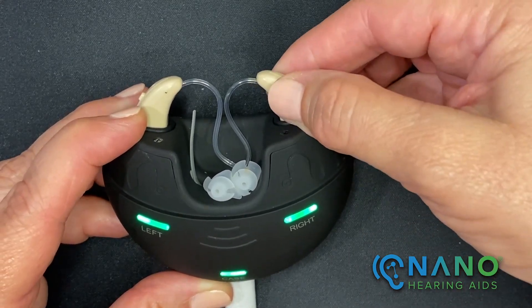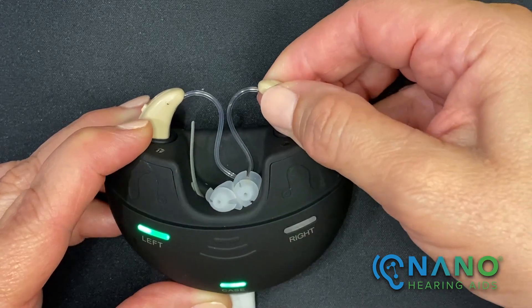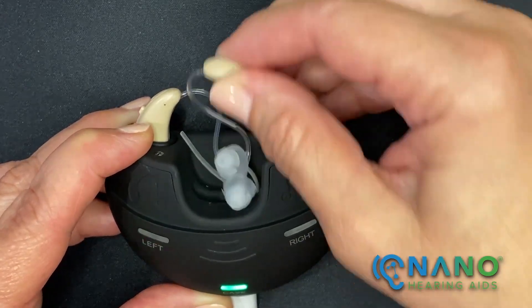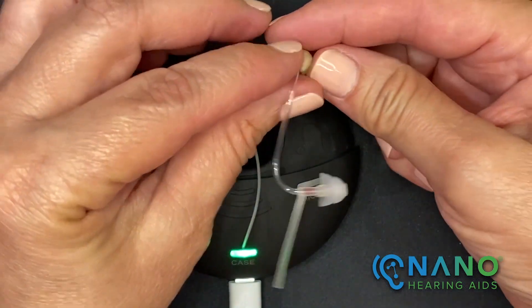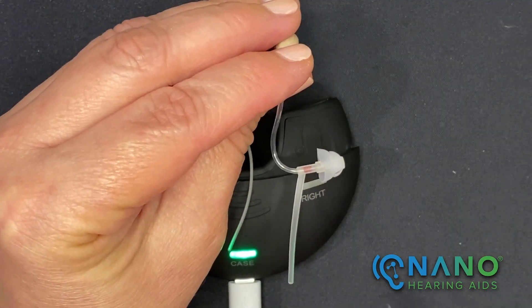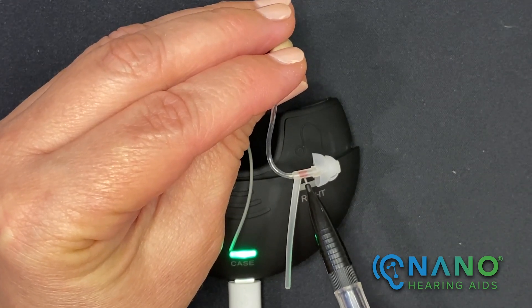As I take the right hearing aid out of the charging case, you'll notice the light will turn off, indicating that it's no longer charging. The right hearing aid has a red indicator located right here.